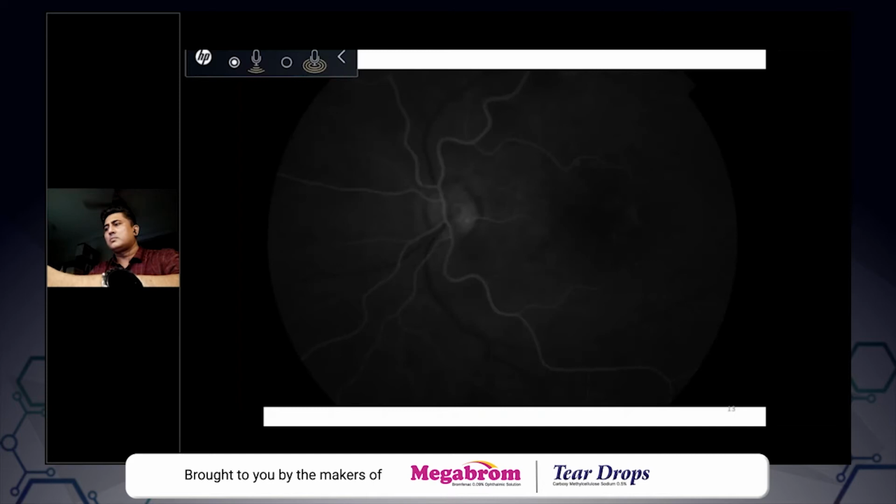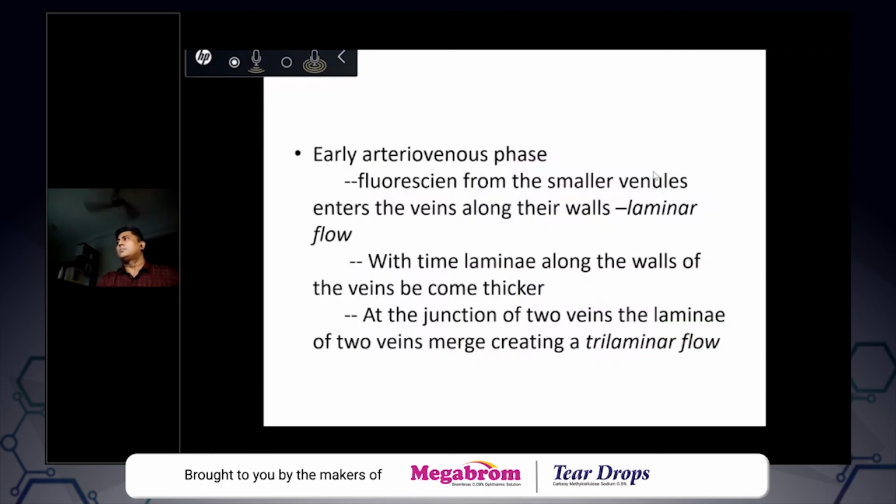So you look at this. The dye has entered into the capillary, into the artery. Dye is going into the periphery now. So it is going into the arteriole, then into the capillaries and into the venules.